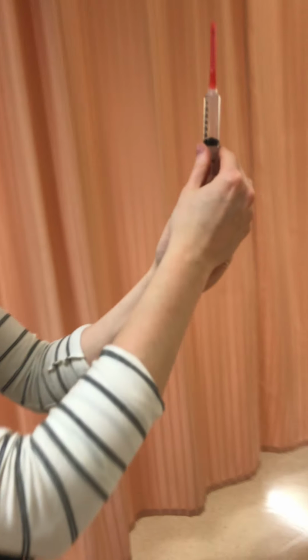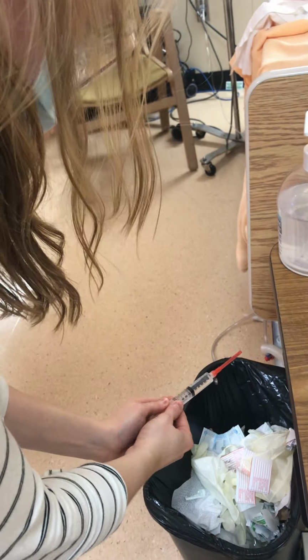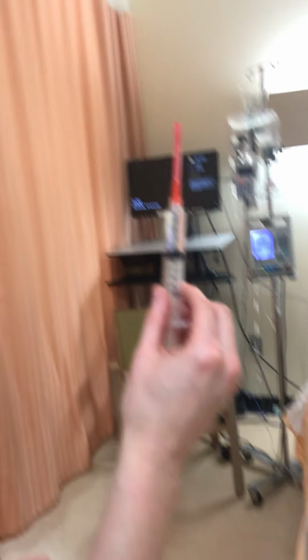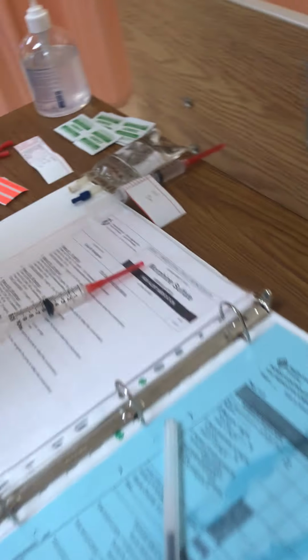Okay, so I'm going to quickly push the bubbles out, and I see I've got a little bit more than 5, so over the sink what I would do is get rid of this and waste it until there is 5. So I've now got 5, and I'll quickly label this syringe.